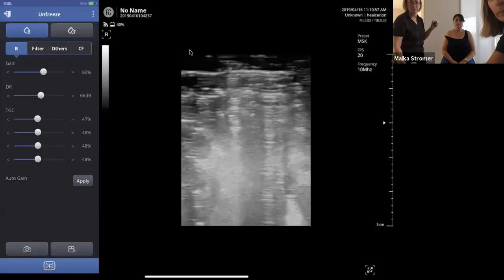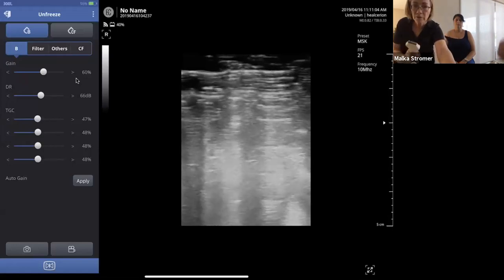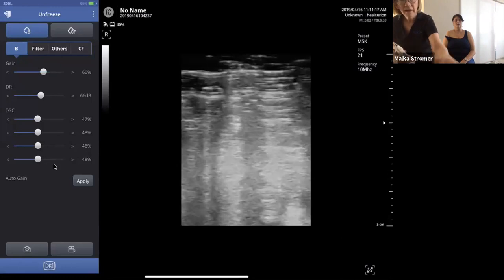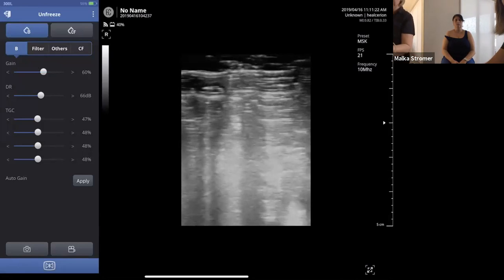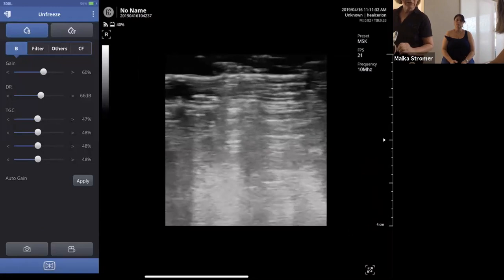There we go. Okay, a couple of things I'm going to show you here. Changes we're going to make on here are gain in this knob right here, to make it brighter or darker. And then we'll go over to depth to make the picture bigger or smaller. This is a personal preference. It depends on the size of the patient, but generally we're going to start at about a 4 centimeter depth.